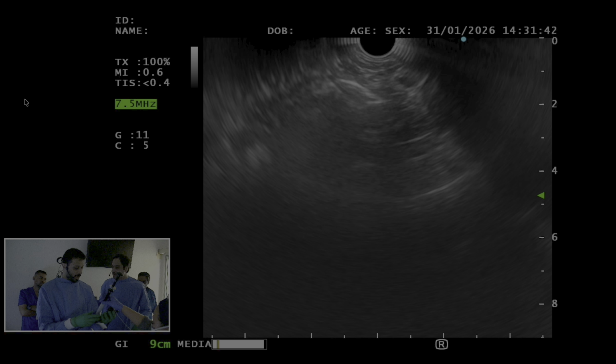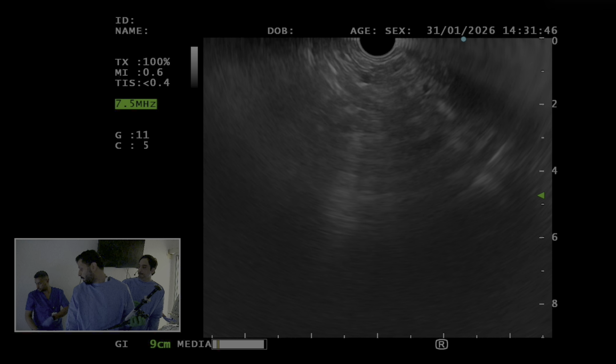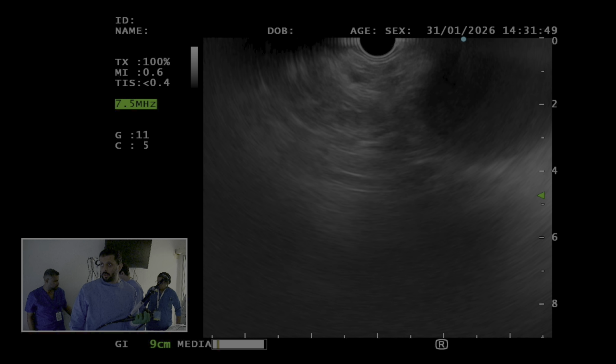I'm gonna... Yeah, give us a second. Closer here to... we go, you, go. Yeah. Yeah. So you want to pass by? Oh, let's go here. Sorry.